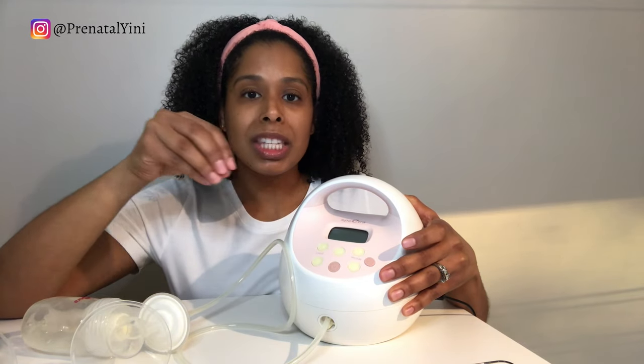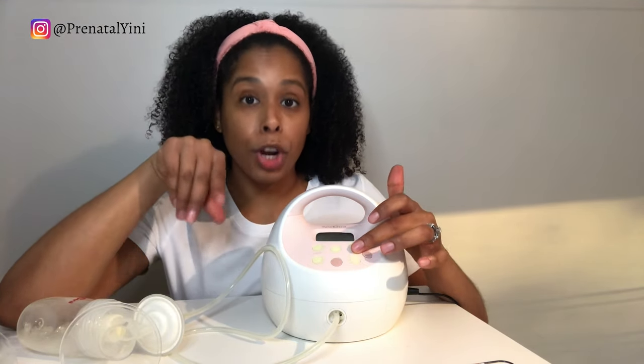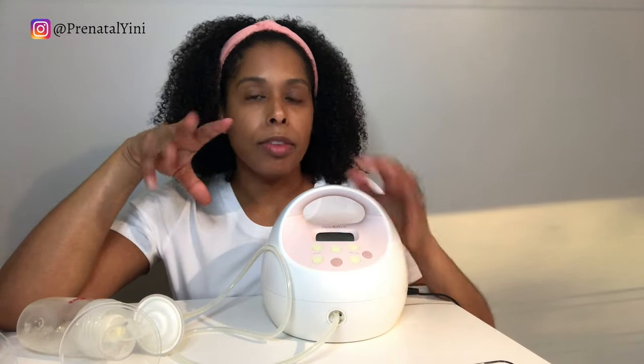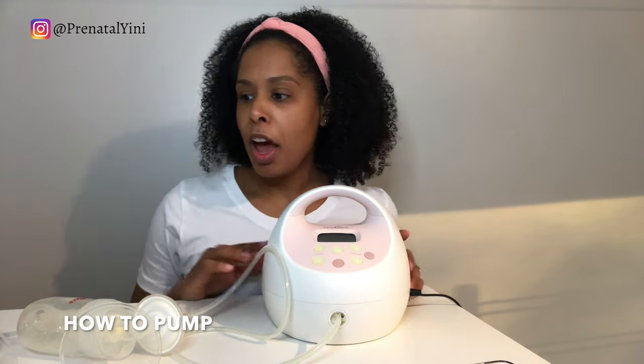In terms of vacuum, you have to find the right level for you — no two moms are the same. Pumping should not be painful, just like breastfeeding. You want that pulling sensation but it should be comfortable. If any setting is painful, lower the level immediately. Leaving it on a painful setting will damage your breast tissue and nipple.